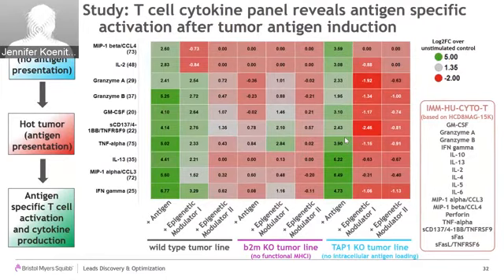Then, instead of actually providing the antigen to the co-culture, we instead treated the tumor cells with epigenetic modulator 1 or 2, to see if interfering with several of these pathways, we could achieve the same effect, so induce antigen expression in a tumor that normally does not express this antigen. And as you can see, for the epigenetic modulator number 1, we actually do get a good response.